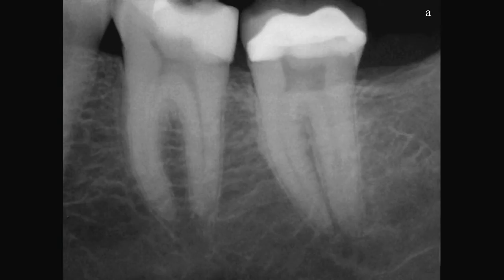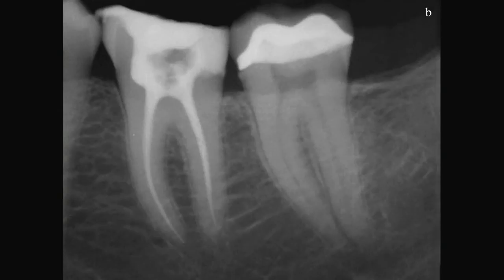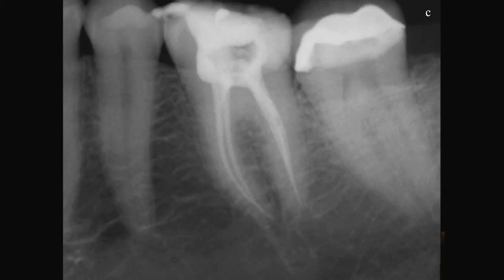I use gutta-percha and 3D obturation — the same principles, only I use PIPS prior to filling, and this is the kind of fills we're getting. Still very conservative; I don't go usually past a 20 ISO size — this is .04 tapering. I use GT taper.